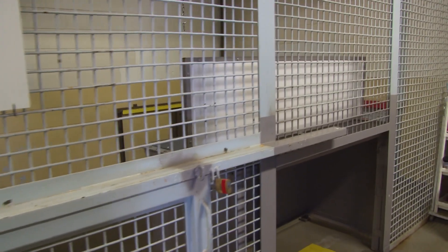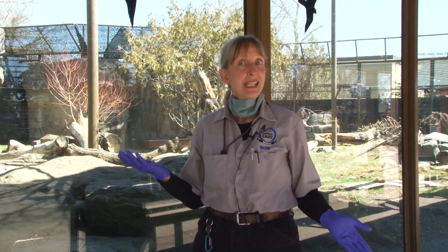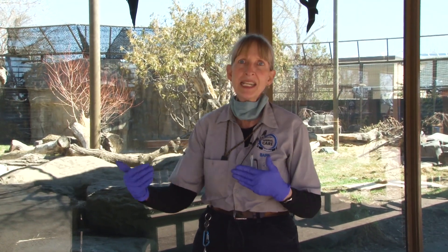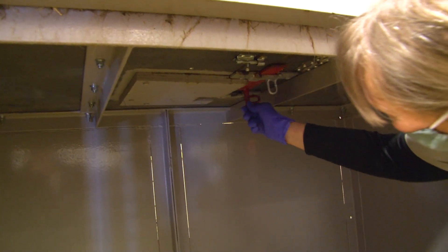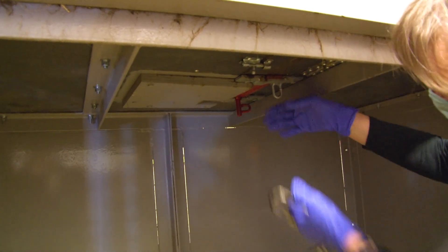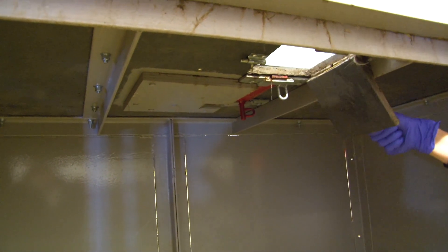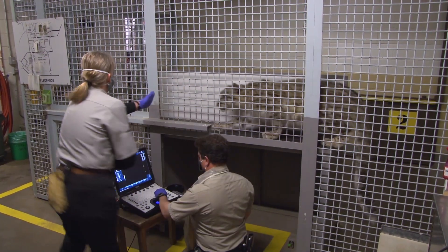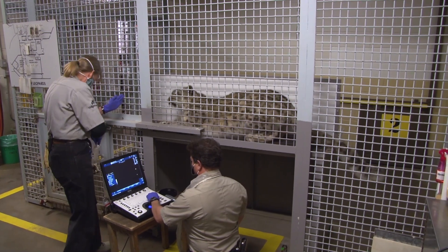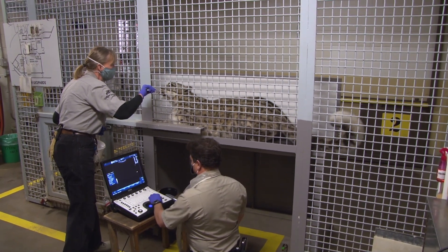What's really cool is that we have an ultrasound table. It actually doubles as a platform that they can sleep and eat on. And when it's needed, we can do injections, injection training, and we can do ultrasound exams on her. The ultrasound table is quite unique — it actually has openings in it so that we can access the snow leopard. We'll ask Laika to jump up on the ultrasound table. There's a platform, or actually a bit of a wall in the back, that keeps her in place so she doesn't relax too far away. She will line up right along the mesh.